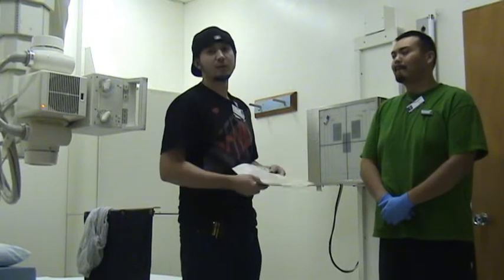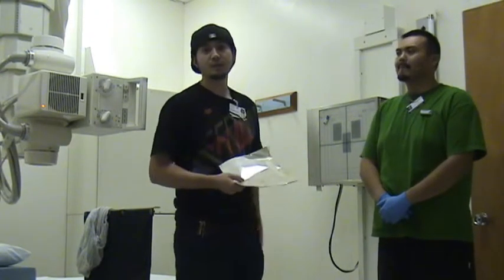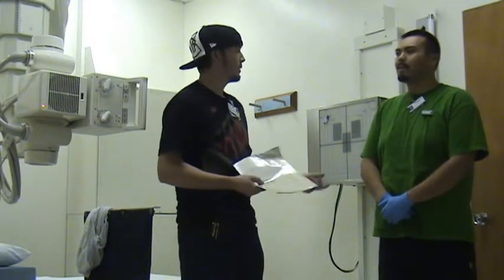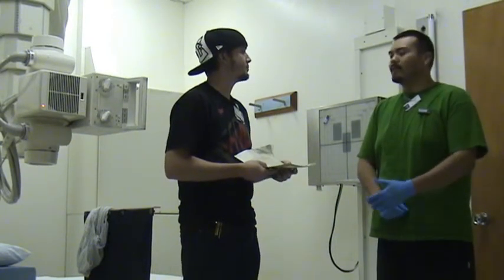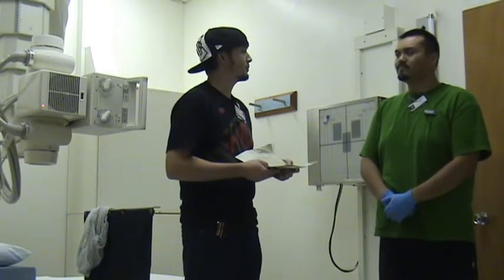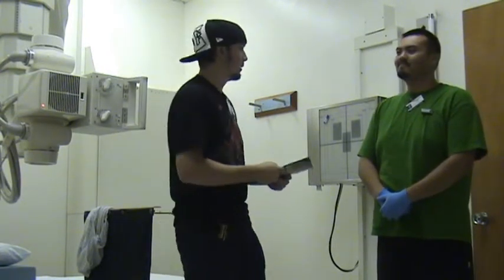You also want to ask them what type of history they have, and the reason why they're here. Sir, why are you here? It's just a pre-op exam. I'm having surgery next week. Oh, okay. Just like that, ask for some information and jot it down in the DICOM later. So we're going to get this patient set up.